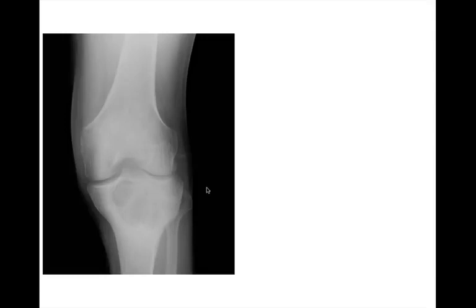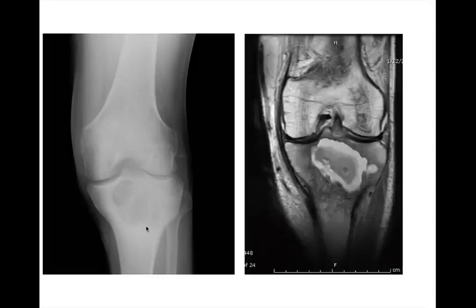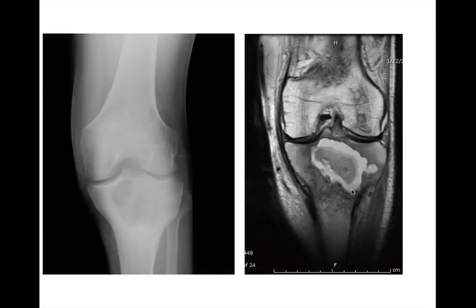Here we have a frontal radiograph of the knee — we've seen this one already. This is a geographic lytic lesion, narrow zone of transition. It has perhaps a slight sclerotic border. This lesion is centrally located in the epiphysis and metaphysis of the proximal tibia. On MR we can see the extent of the lesion spanning from the epiphysis growing into the metaphysis, with a fairly narrow zone of transition. This one was a Brody's abscess.